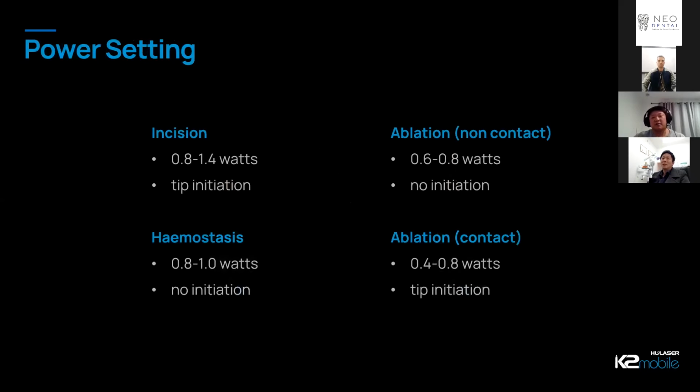So, from my experience, depending on how you use the laser, whether that's a pulse mode or continuous mode, the energy output and the speed you're moving it, you can get different effects. And personally, I found that you need to play around with these different factors to find what works well for you in your hands. And I found that as dentists, we're quite familiar with the contact approach, given that most of what we do involves a handpiece and a bur touching a tooth. So we get that tactile feedback, and the laser can be used in that same way. And that's probably why, admittedly, I haven't delved into those other modes that we can use the K2 laser in, just because I'm still inexperienced in that field. But definitely contact mode is something that comes very naturally.